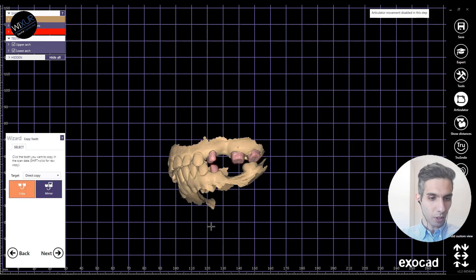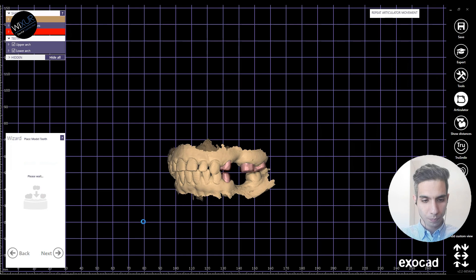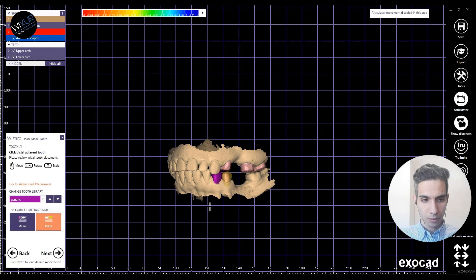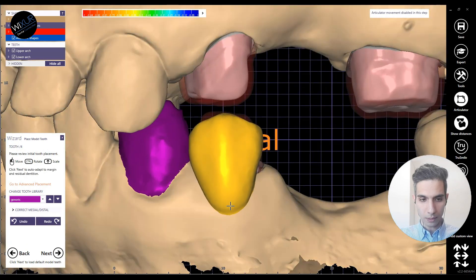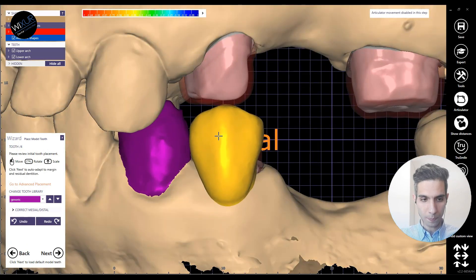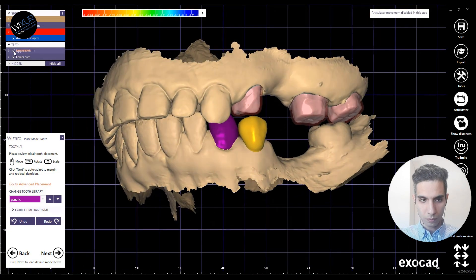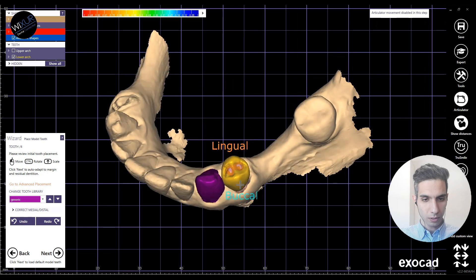The copy or mirror window — I don't need it for this case, so just click next. Here I'm going to do the tooth placements starting with the lower jaw. Remember, always use the hotkeys for faster design.